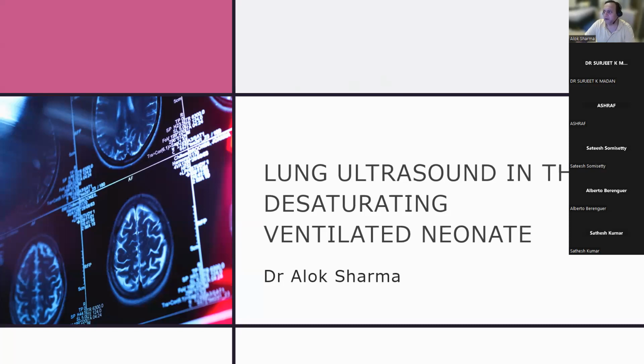What we're going to talk about is basically lung ultrasound in a desaturating ventilated neonate. So I'm going to give you some histories, and then we're going to get two of you to work in groups. We should always work in groups.